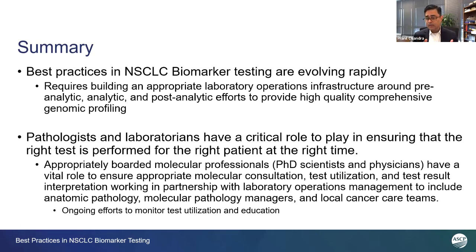And this team that is necessary includes molecular pathologists, surgical pathologists, operational lab managers, AP managers, molecular pathology managers, and local care teams. One of the things that we're now starting to implement is actually monitoring test utilization and then continuous education.